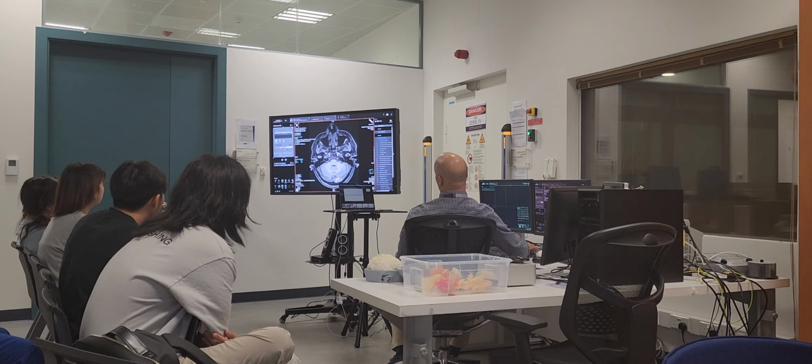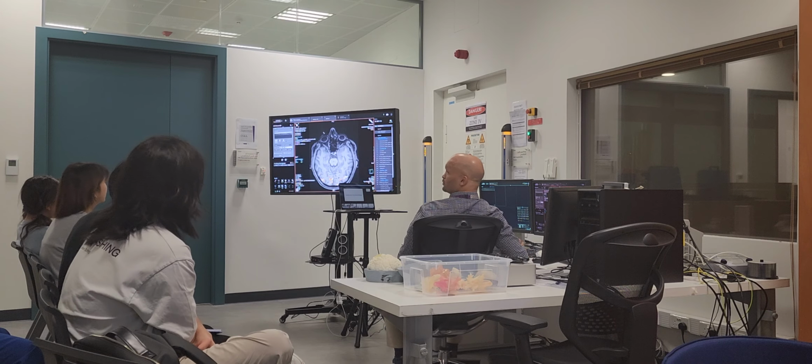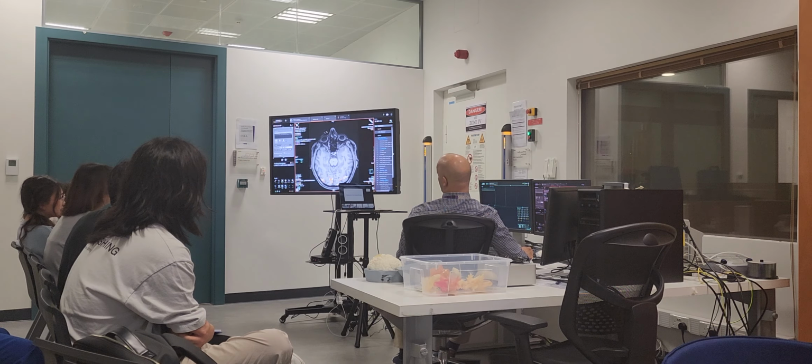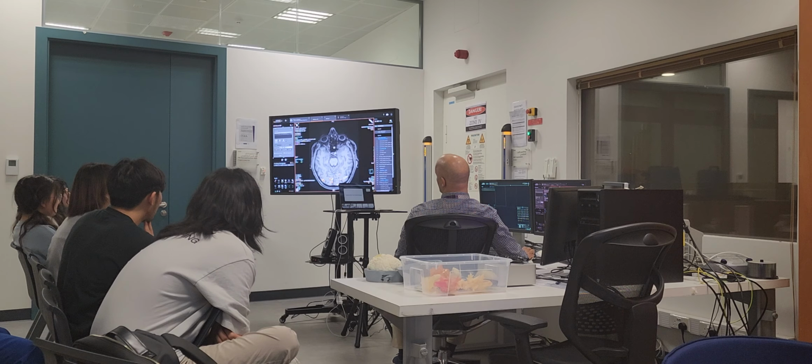Okay. Now let's talk about the visual system quickly. Let's find the eyes. Here are the eyes. Okay. He was moving his eyes. You see what motion does? It's this ringing. See this ringing thing? As if you're taking a picture with your camera and your hand is shaking. Okay? But look at this. It's very hard to see because he was moving, but there is a nerve, this nerve coming to the eye, and then that nerve. See, here's the nerve here.